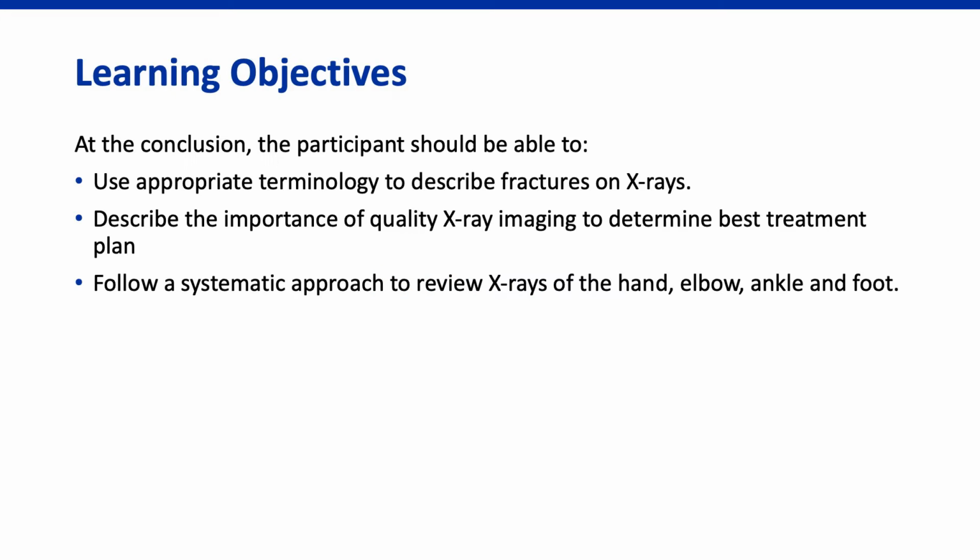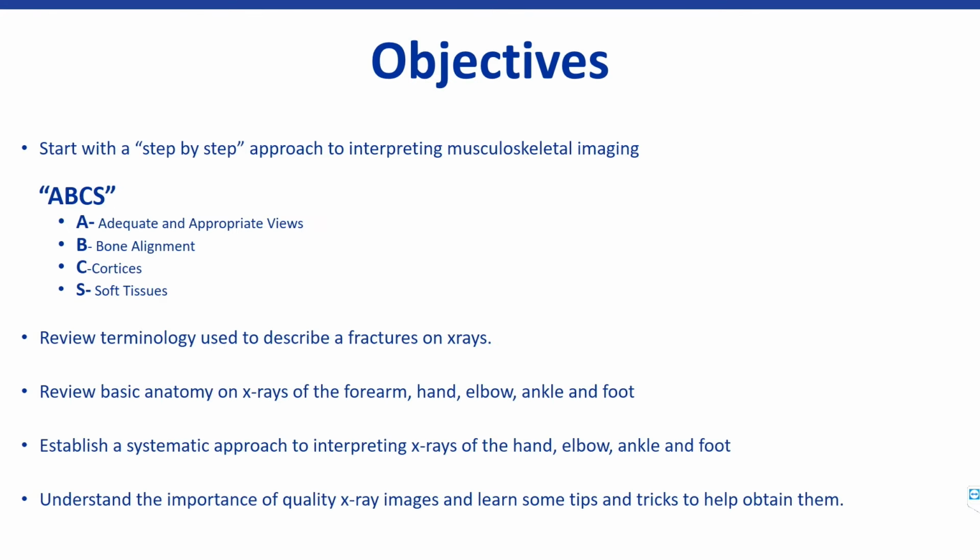We've listed our objectives here clearly. I'm not going to go through these one by one, but I do think it's important to mention, I truly believe that a step-by-step methodical approach to reviewing x-rays is really important, much like our clinical exams. There are several ways to do this, and if you ask 10 people, you may get 7 or 8 different answers. One of the mnemonics I use to help me is the ABCS.